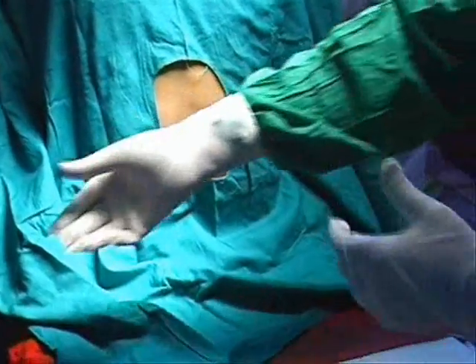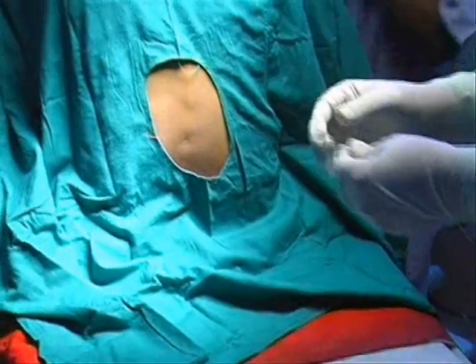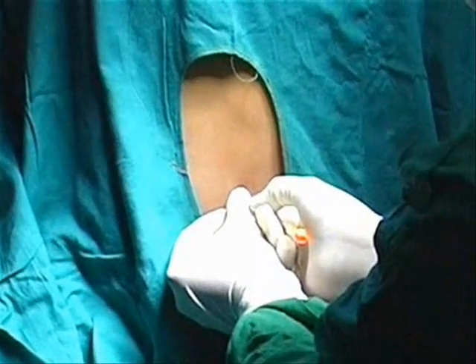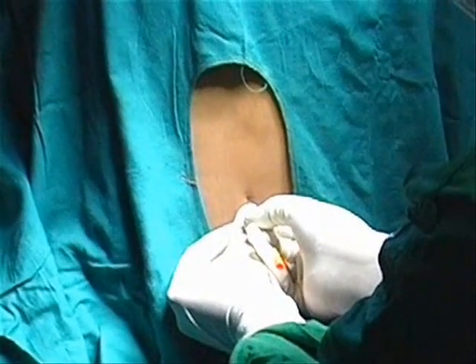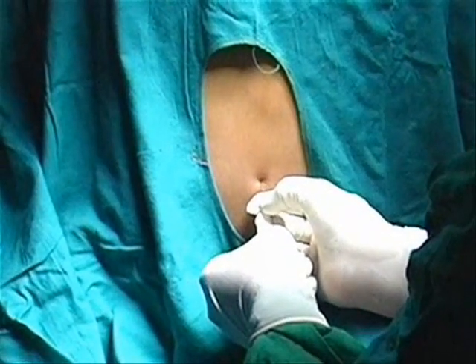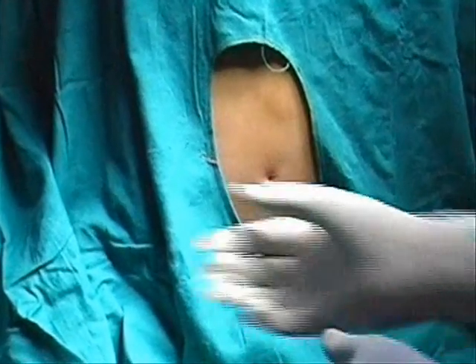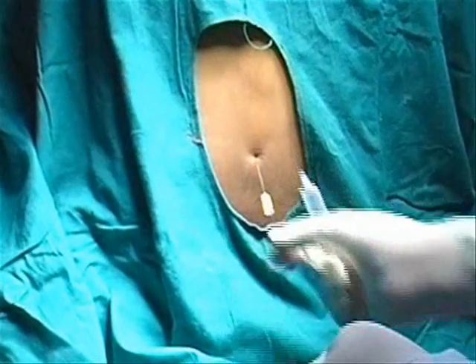For the procedure itself, take the needle and hold it like you would hold a dart, then slowly start inserting it in the interspace after you have made a little mark with the nail of your thumb so you know exactly where you are going to poke. Advance it slowly, slightly in a cephalad direction, and when you pierce the dura mater you will feel a little pop.